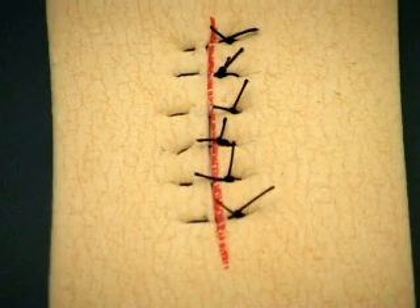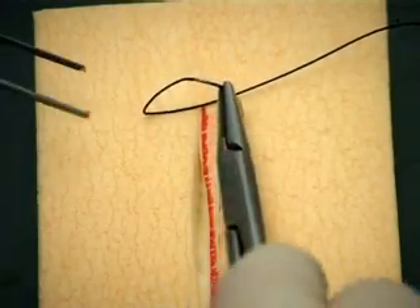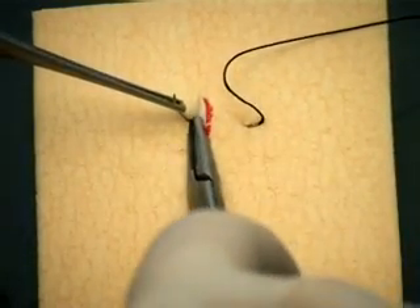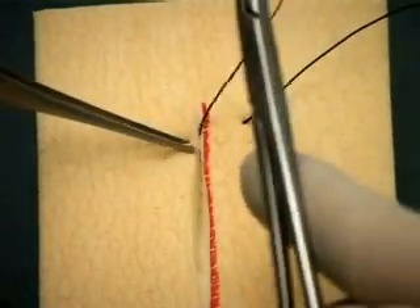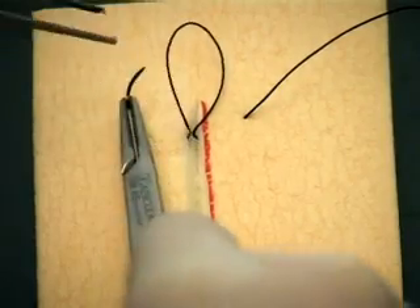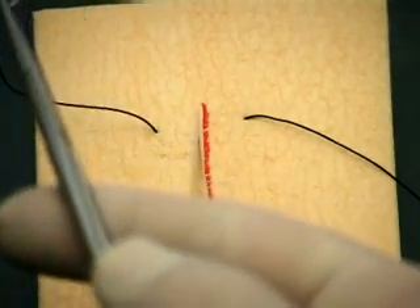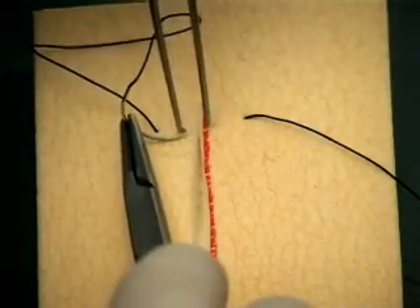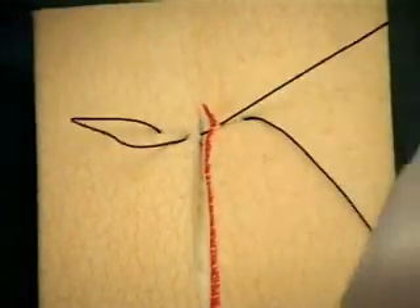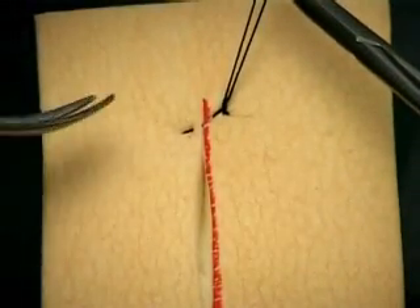There are two types of mattress sutures — the vertical and the horizontal. Starting with the vertical mattress suture: take a bite a distance away from the wound edge and follow through on the curve of the needle. Re-grasp and take a second bite on the opposite edge of the wound, an equal distance away. Grasp the needle and re-orient the direction of the needle in the needle holder to face the opposite way. Place the second set of sutures 2 to 3 mm away from the wound edge, keeping parallel and just below the surface. Tie a knot, and your assistant will help cut the ends of the suture.